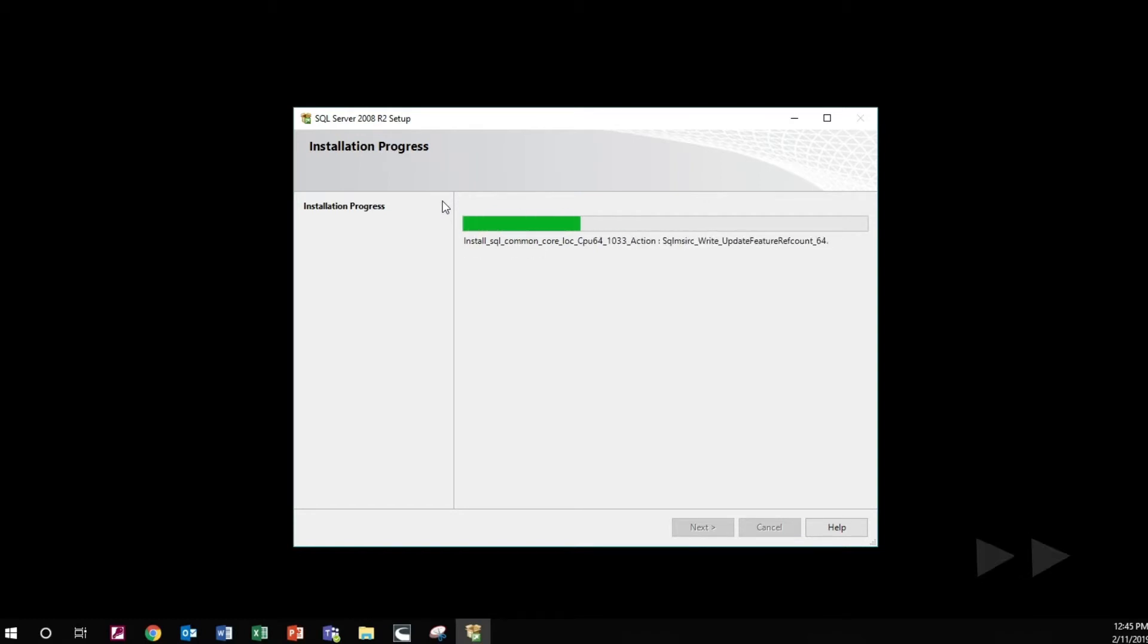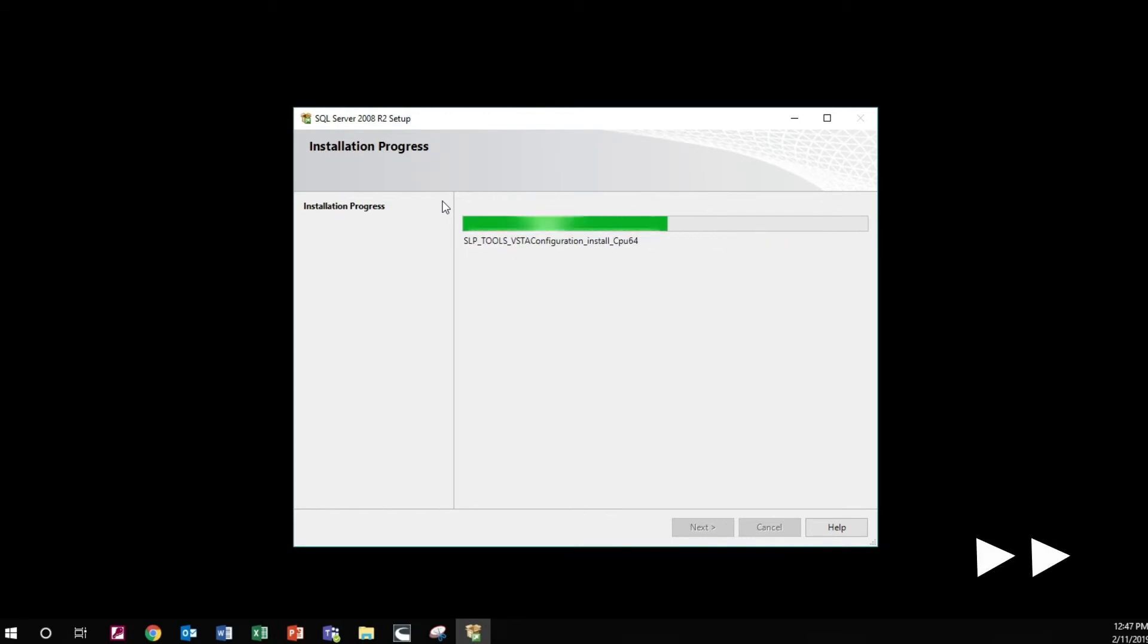The SQL server installation will continue by installing the setup support files. This window will be the final step when installing the SQL server.